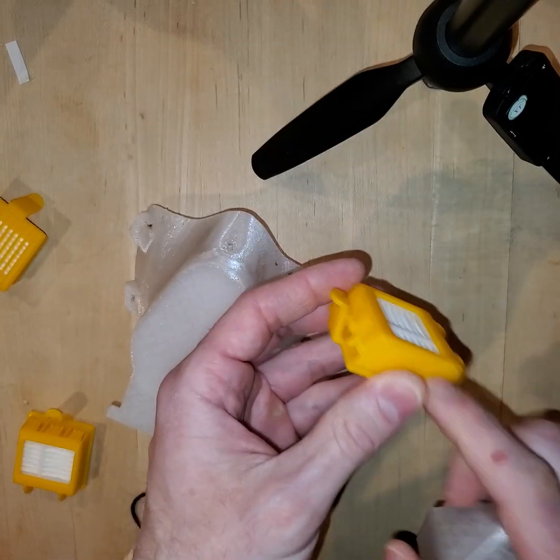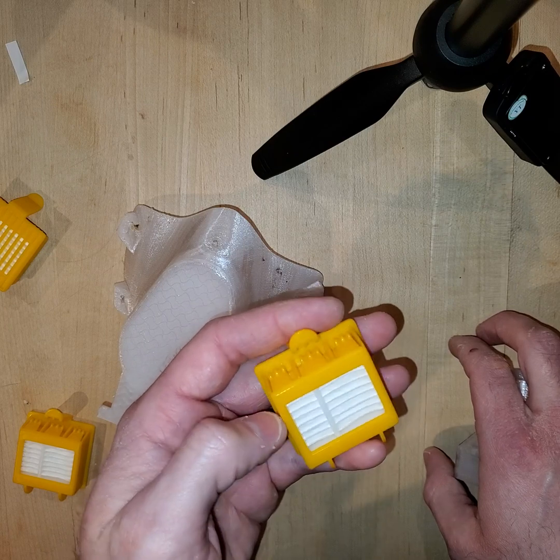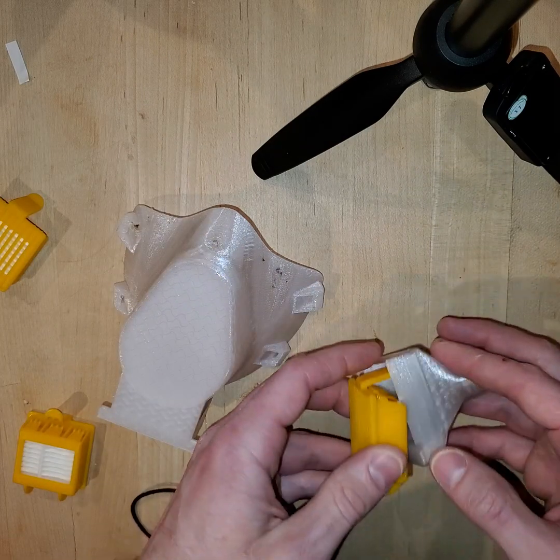You can find a link to these. These are less than $1 a piece on Amazon, so they're truly just a throwaway product.